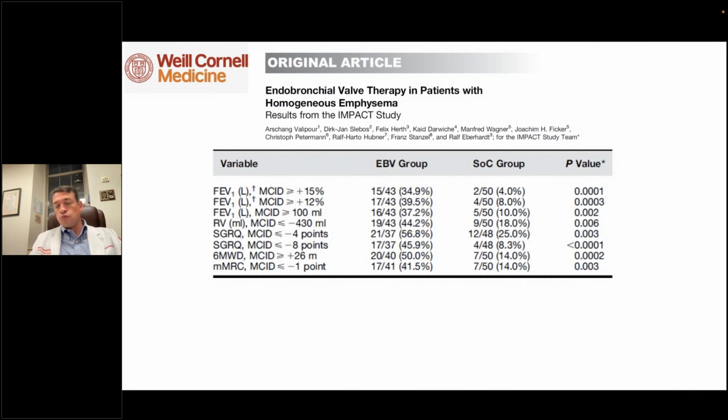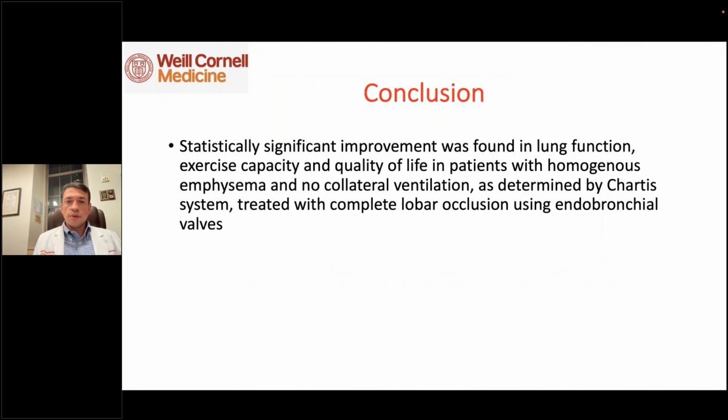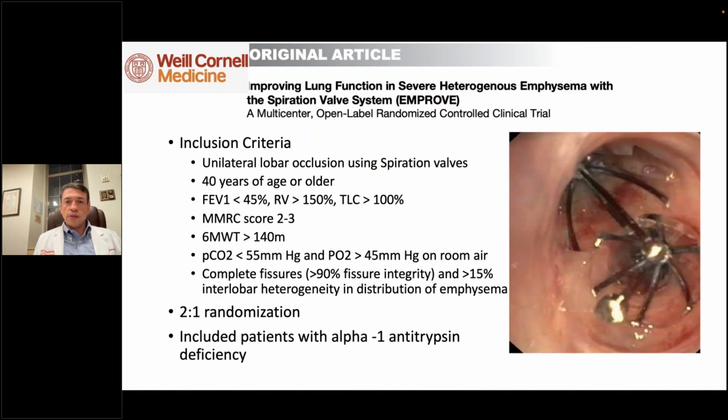So this is the reason why we are offering this to homogeneous emphysema. Remember, Olympus Spiration valves were not studied in homogeneous patients. So the FDA approval for homogeneous is only with Zephyr valves. And we talked about the conclusion.